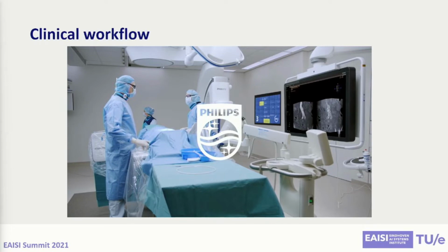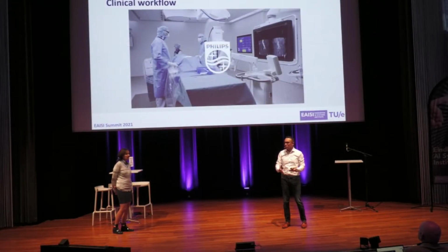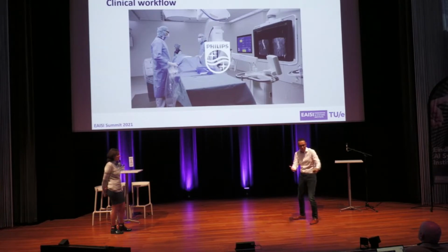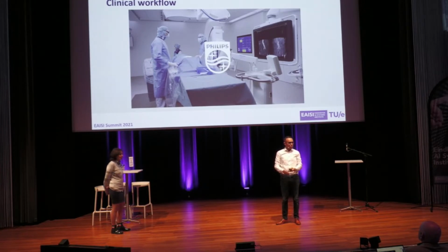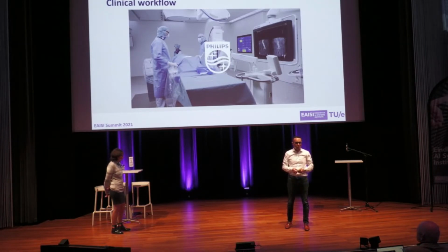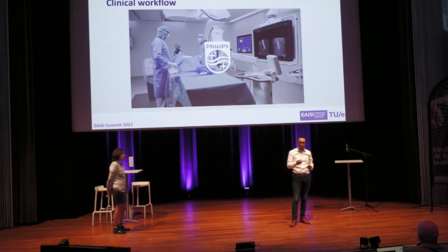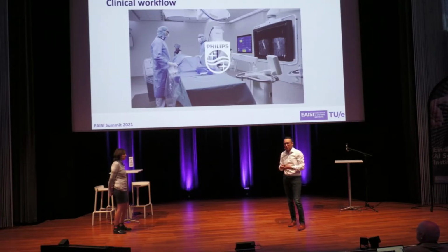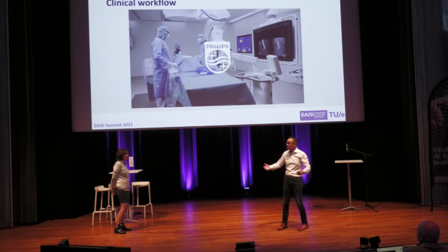And what you see there is actually a robot that collaborates with humans, that interacts with humans. It is not a robot that we have at the back and then we bring the patient to the table and check what is wrong and where it is wrong. No, we have a robot that actually works with the physician at the same time. So this is why we are doing this research now. We want a full synergy between the physician and the robot. We want them to really cooperate together. And we want the robot to move safely in this environment.